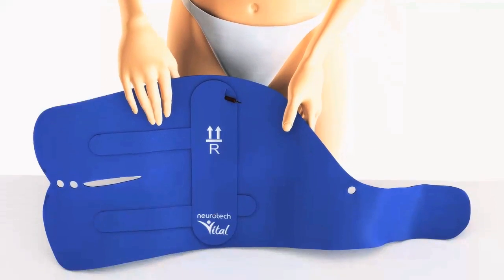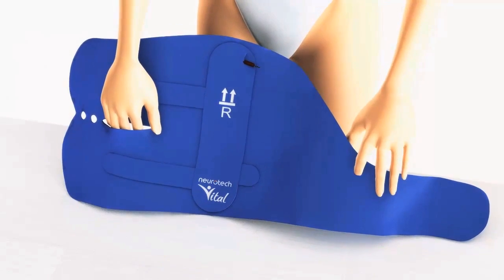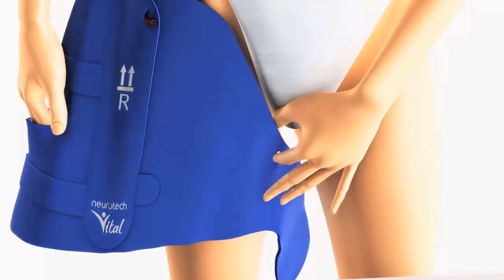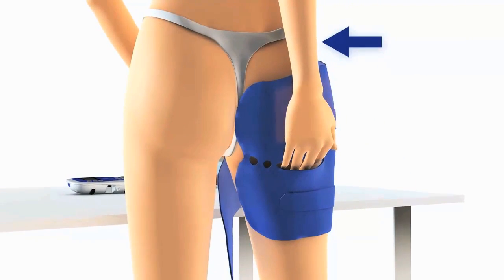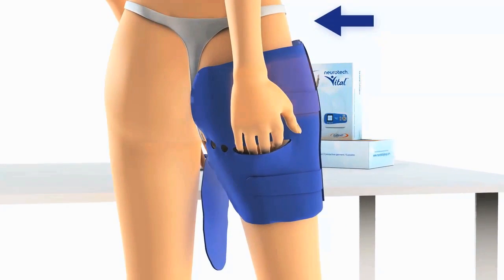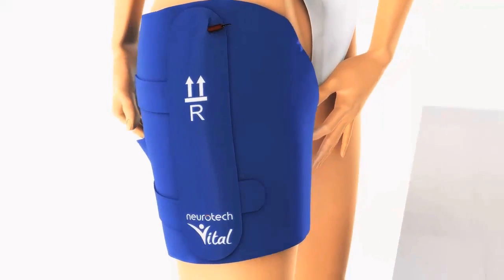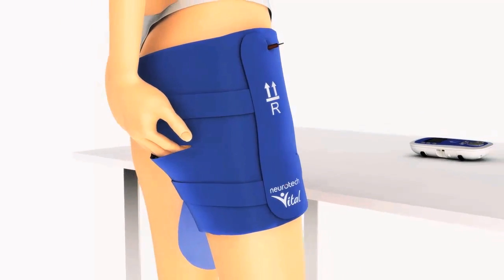To put on the right thigh garment, put your right hand in the slit and your left index finger in the small hole. Bring your left index finger over to the upper inner area of your groin and the fingers of your right hand to the crease below your right buttock. Then wrap the garment around your thigh and fasten it with the velcro fastener. Make sure that the garment is fixed firmly and that all the electrodes have good contact with the skin. The side panels of the garment must be in line with the outer side of your leg.